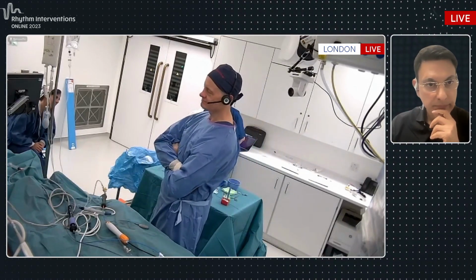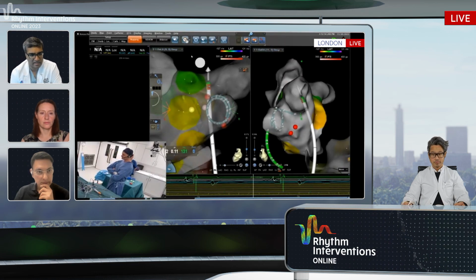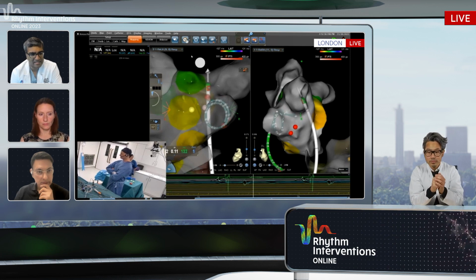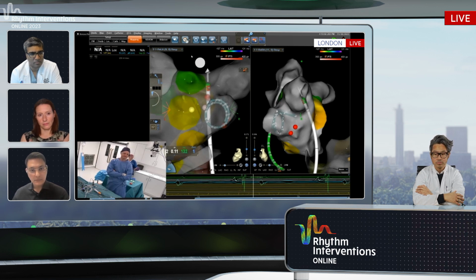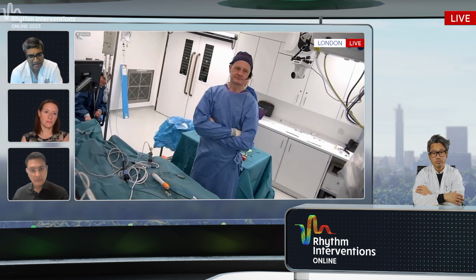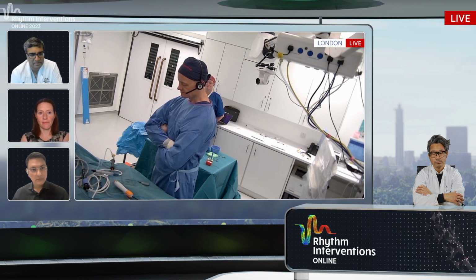Yeah. So look, one of the issues is that unfortunately, PV reconnection continues to be relatively common. So in that situation, while I would love to believe that the PV was the cause, and indeed I still think it probably is the cause, just to be clear, it's still possible that there's a non-PV trigger that initiated this. And again, the patient came in and fluttered. We don't know if they also had some episodes of fib or whatever, and that certainly would modulate your decision here. But I do tend to give isoproterenol anyway.